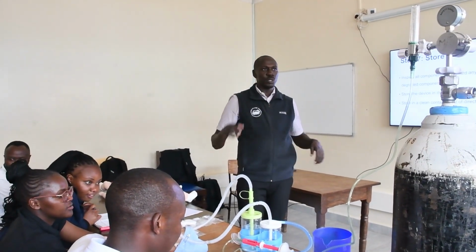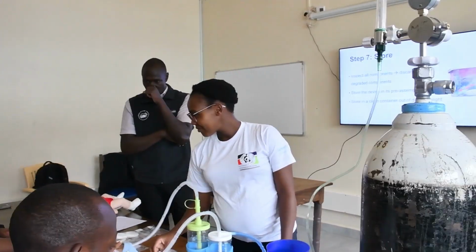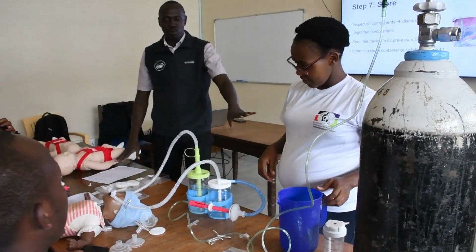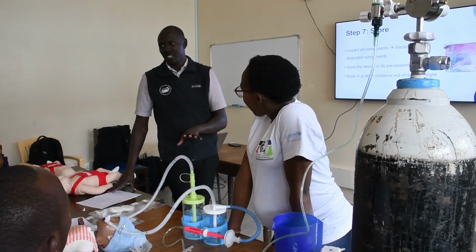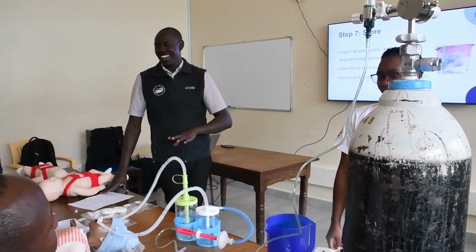So come and demonstrate how to disassemble the device. Come on, before we disassemble, let someone come and do monitoring so that we disassemble after monitoring.